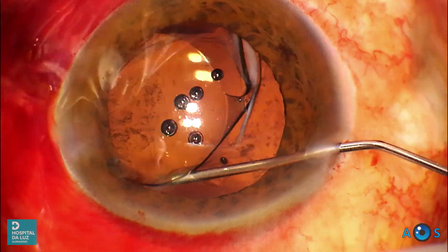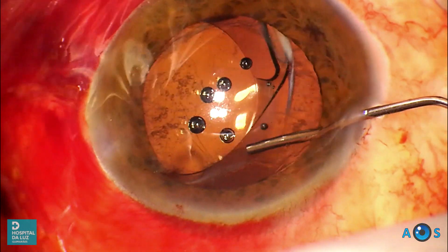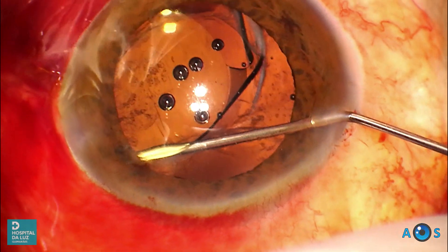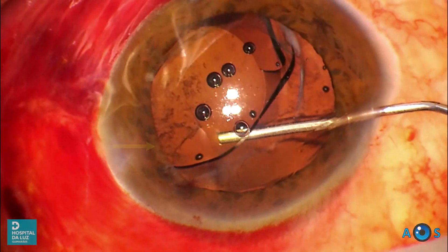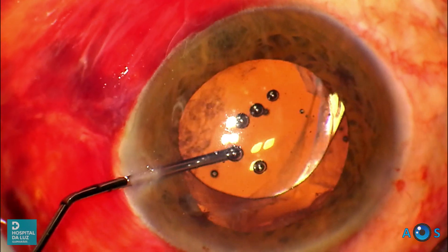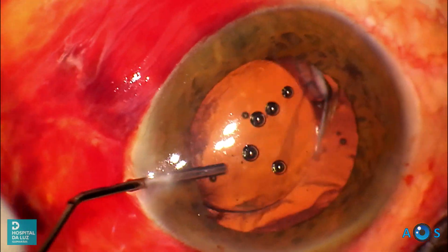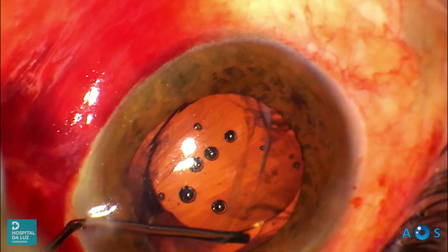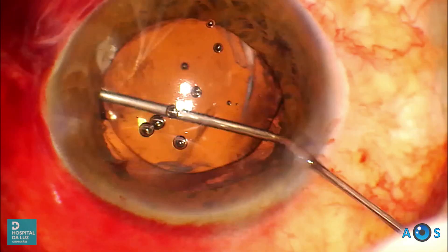Patient and persistent OVD injection pays off in further expanding the bag, in order to allow subsequent IOL rotation maneuvers. Gentle pushing and rotating movements confirm that the IOL is now freely movable and that the nasal haptic was placed in the sulcus. The slowly progressive capsular bag contraction and fibrosis led to the decentration of the lens.